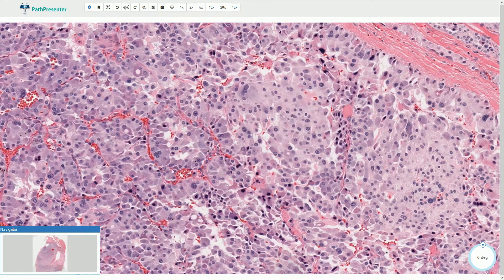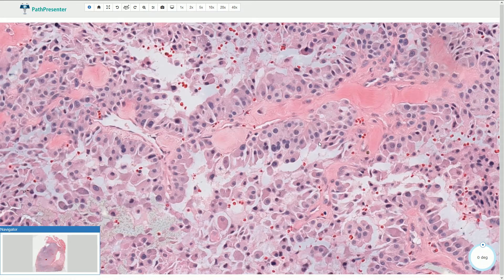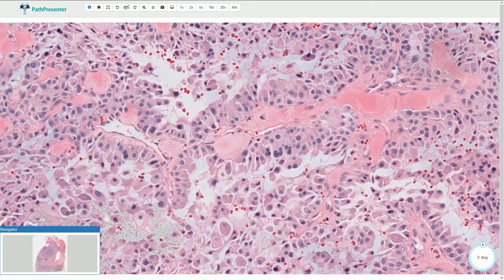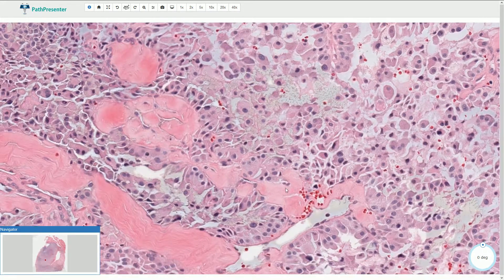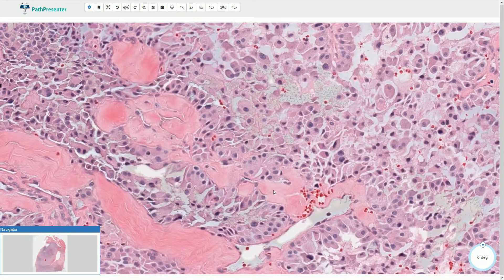Sometimes we can see an insular pattern where these cells are organized in small solid nests encircled by thin fibrovascular septa. Here we have something that slightly resembles papillary type of growth. Sometimes the cells can be discohesive. We can also see a variable amount of fibrosis and, again, amyloid deposition.